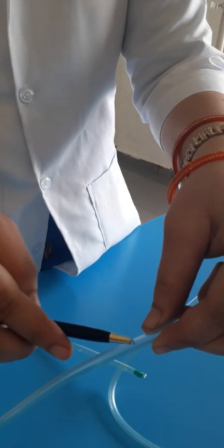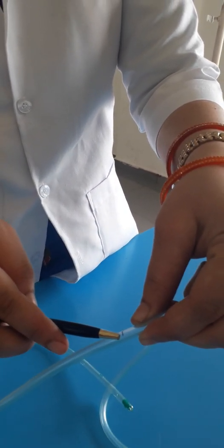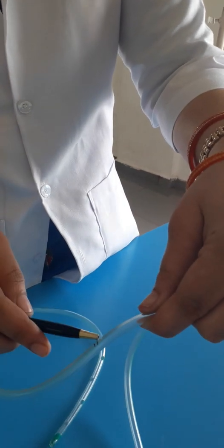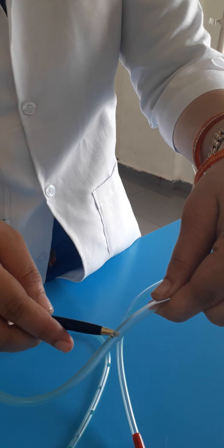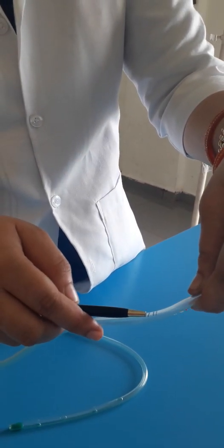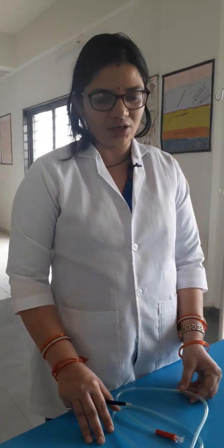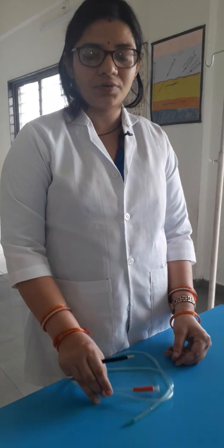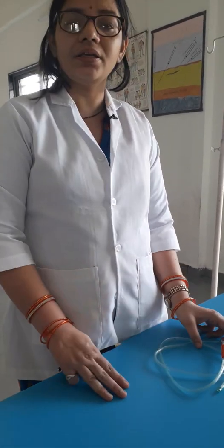Each marking is measured in centimeters and tells where the tube is located in the body. Whenever there is the first marking, it means the tip is in the stomach — that is at 50 centimeters. The second marking comes at 60 centimeters, showing the NG tube is in the pylorus. The third marking is in the duodenum, at 70 centimeters. It is very important to always note down the marking of the inserted tube.